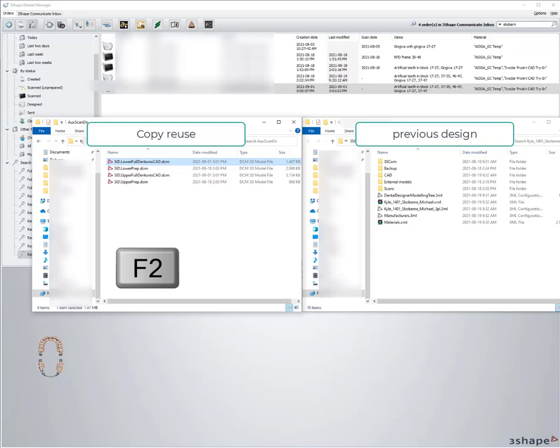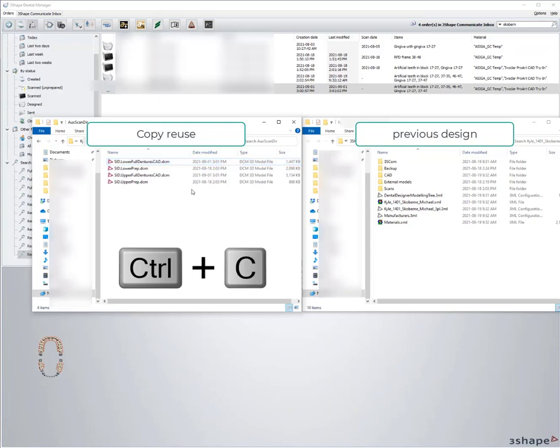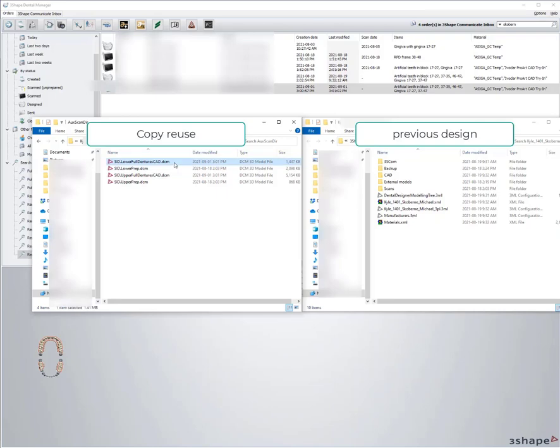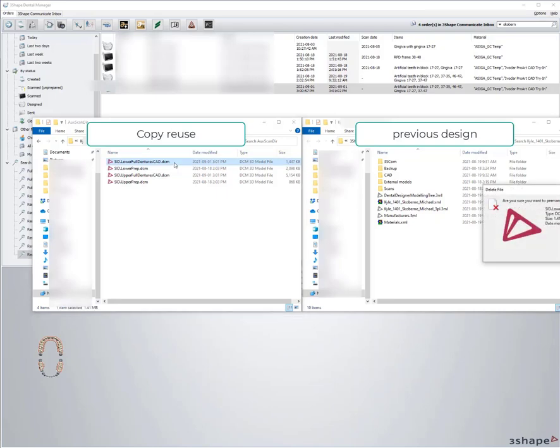I'm going to hit F2 so I can rename it, and then I'm going to hit Control C to copy it to my clipboard. Now I'm just going to delete that file.